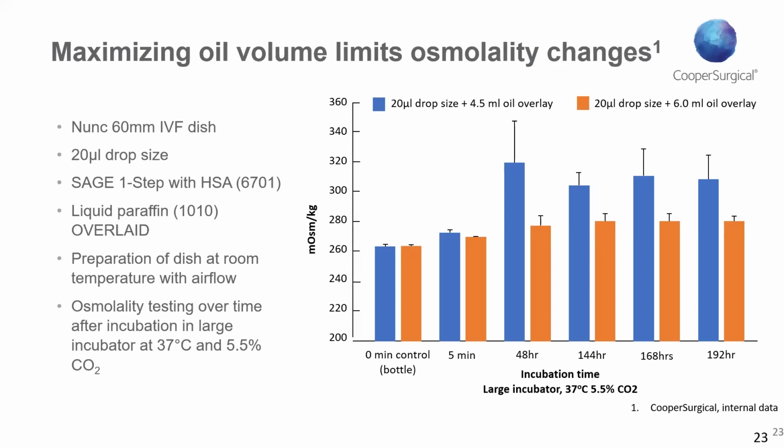But if we used that dish that would set up for 48 hours, sampled it, and then sampled it a few hours later, we would see a consistent rise. Osmolality can only increase because we're not adding anything to the media. We're only observing evaporation. So therefore, it's going to increase dramatically over time, and we can't reverse it in our culture system unless we change the dishes and use fresh medium. So think about the volume of oil that you're using in the dish that you're preparing.